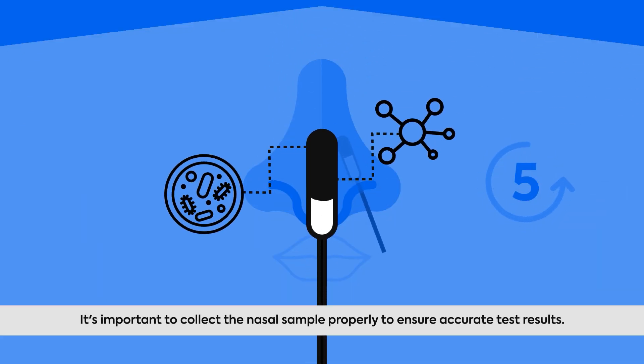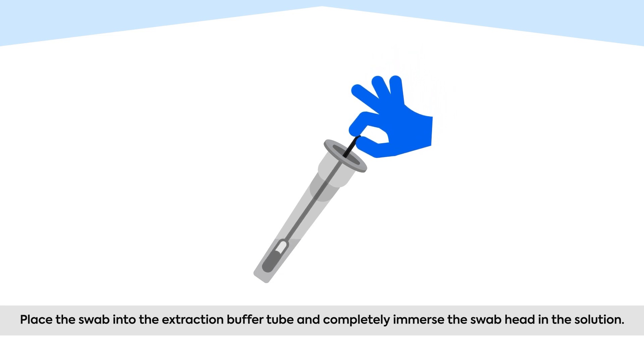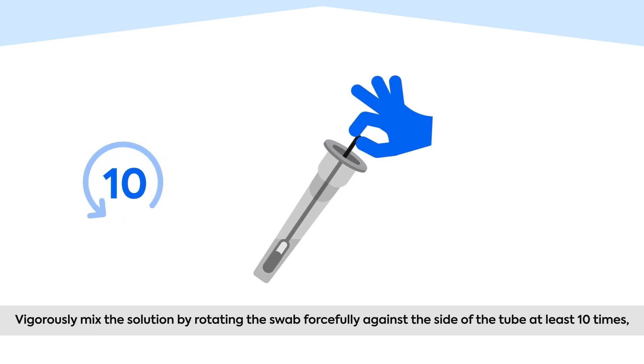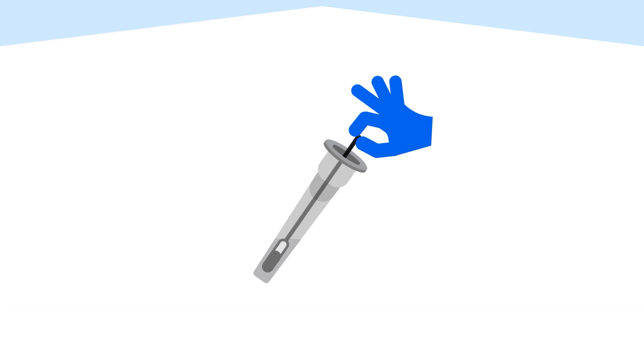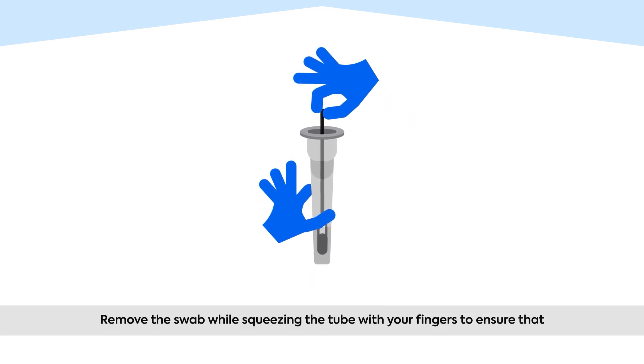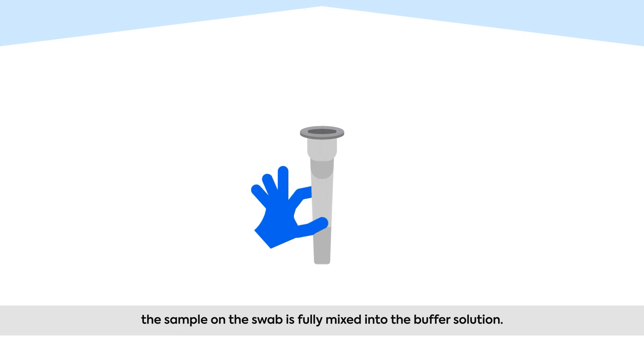It's important to collect the nasal sample properly to ensure accurate test results. Place the swab into the extraction buffer tube and completely immerse the swab head in the solution. Vigorously mix the solution by rotating the swab forcefully against the side of the tube at least ten times, keeping the swab tip submerged in the buffer solution the entire time. Remove the swab while squeezing the tube with your fingers to ensure that the sample on the swab is fully mixed into the buffer solution.